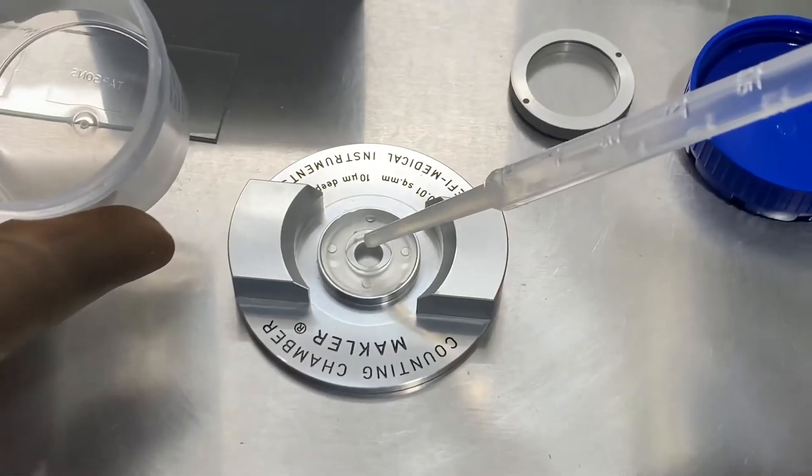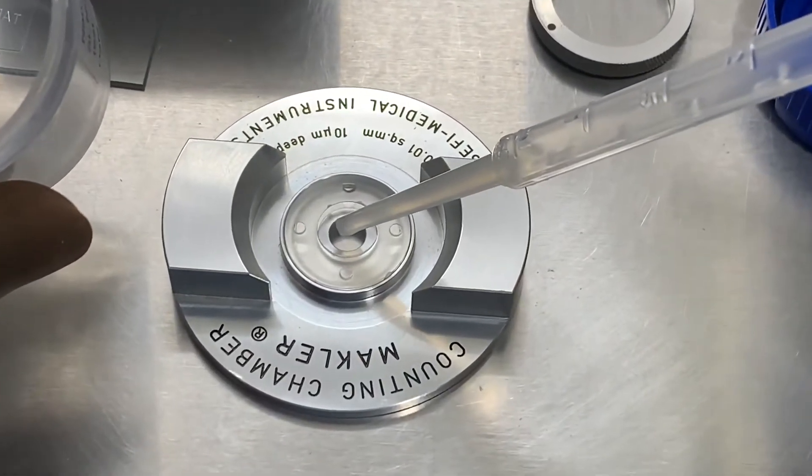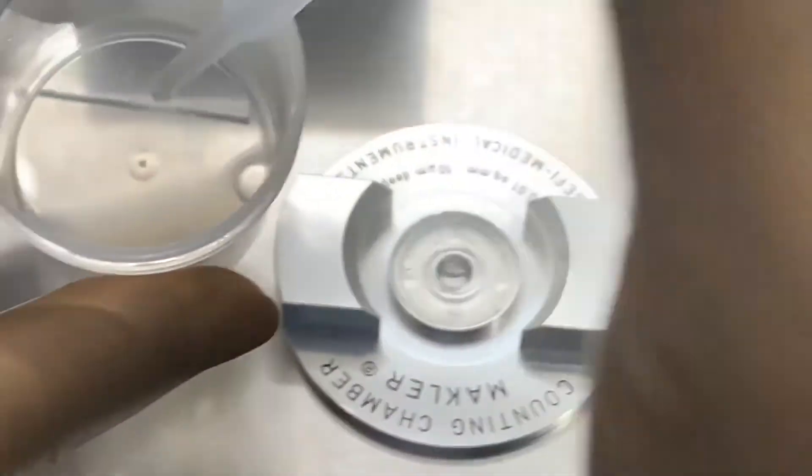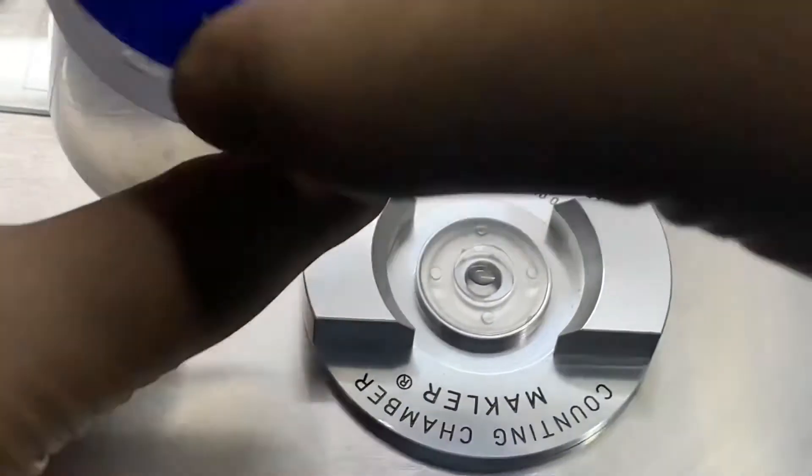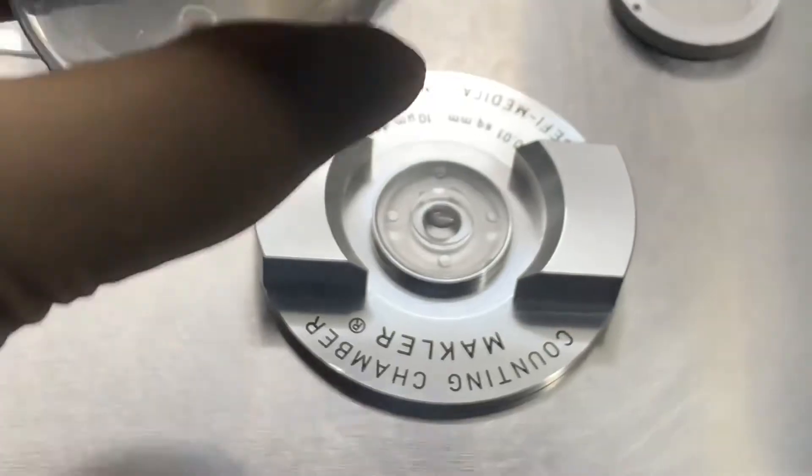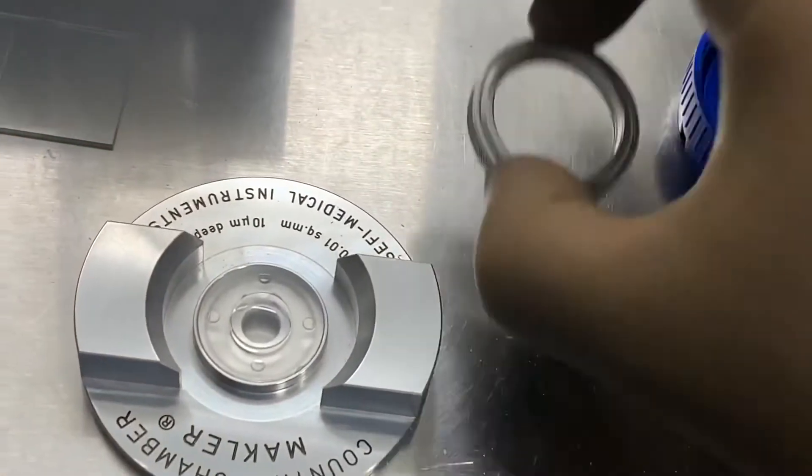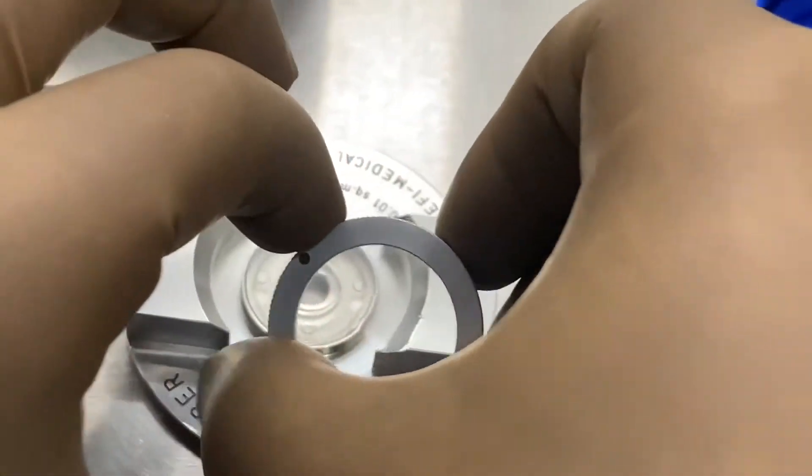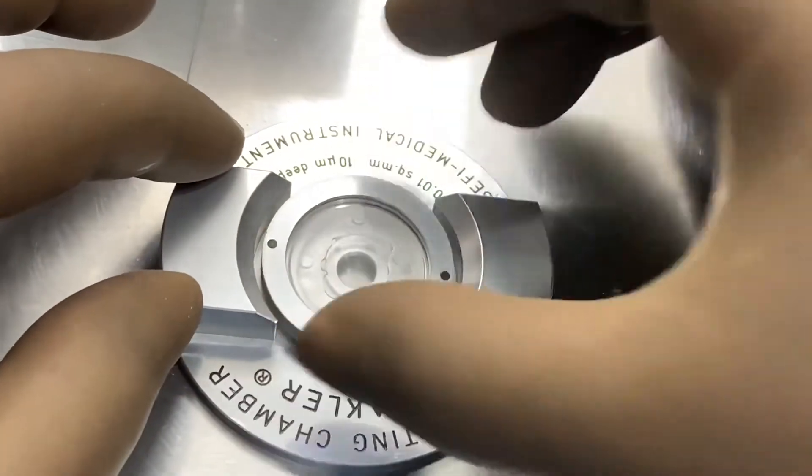And after that, a single drop of semen would be kept on the makler chamber. Then the makler chamber is properly loaded with the coverslip.